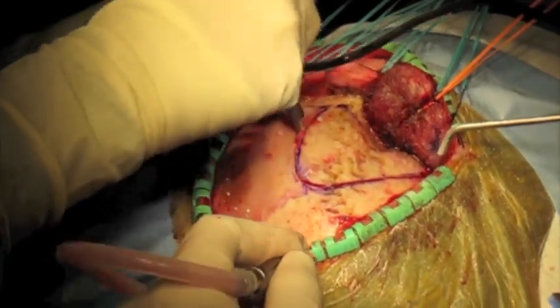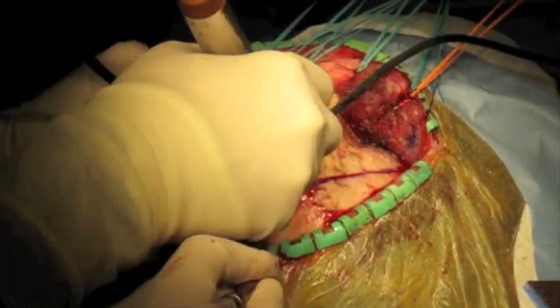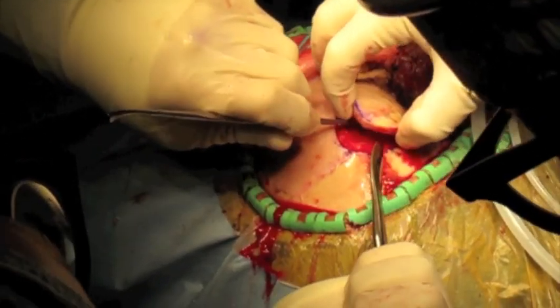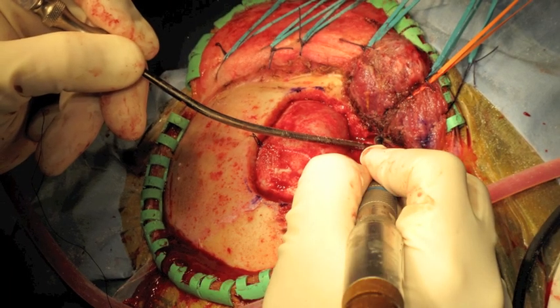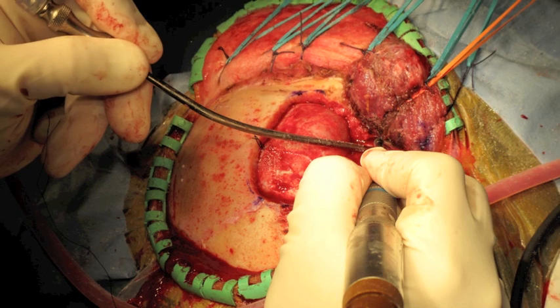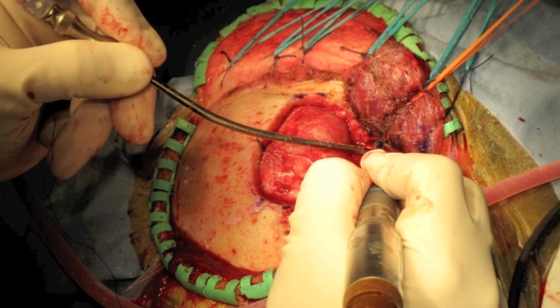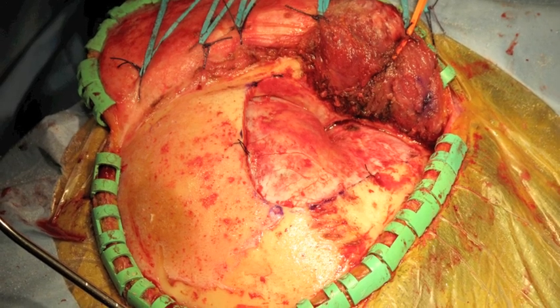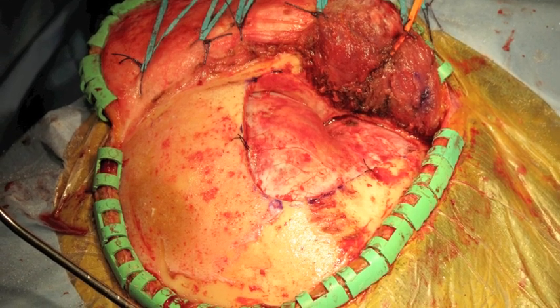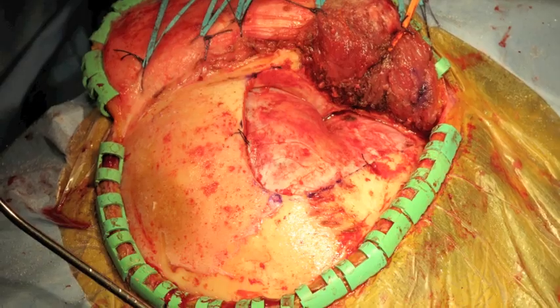A high-speed drill is then used to perform the craniotomy. The bone flap is carefully elevated to preserve dural integrity and the sphenoid wing is flattened using a combination of pneumatic drill and Kerrison rongeur instruments. The bone edges are waxed, dural tenting sutures are placed, and meticulous hemostasis is obtained.